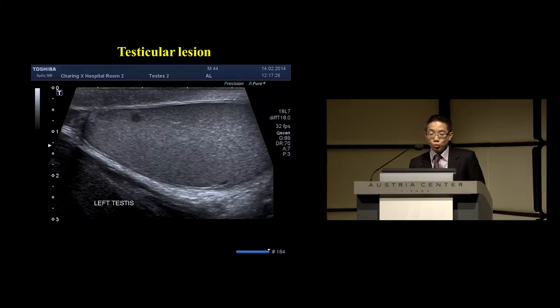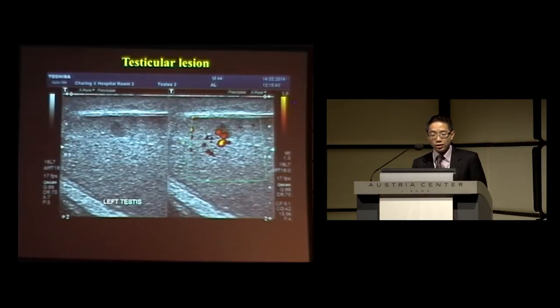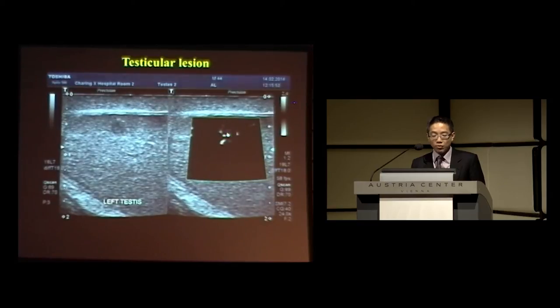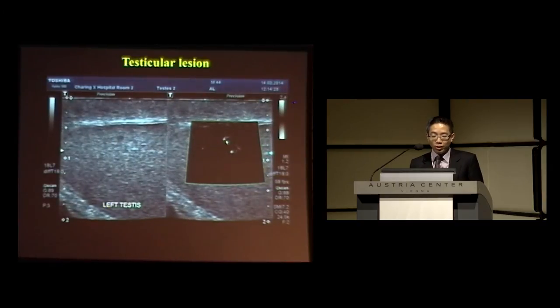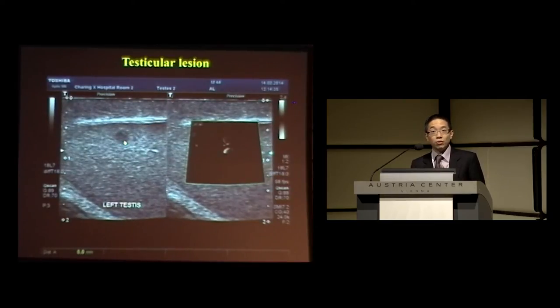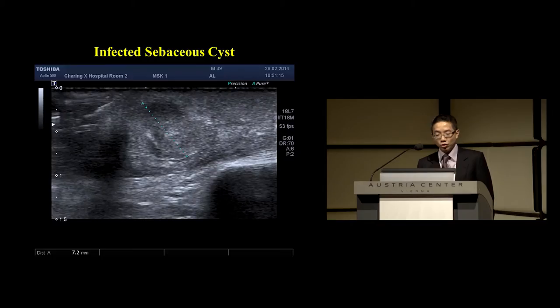Now, how does it do with a small lesion? Here is a testis with a 3 millimeter lesion. The scale here is 0 to 1. As you turn on power Doppler, you seem to get a great influx of power and the whole lesion looks vascular. But when you turn on SMI, you get the impression that there is a fine microvascular network around this lesion and some of it going into it. But what's important is that when it's so small, you're not sure where you are, and here is the cursor matching that of your B mode appearance. So something we found extremely useful was to have this dual cursor in the B mode and monochrome version.